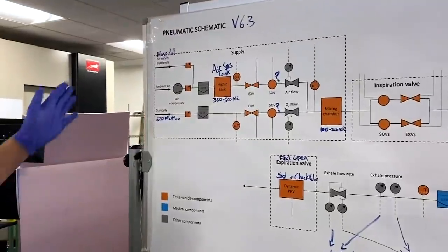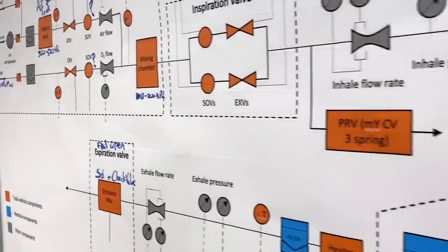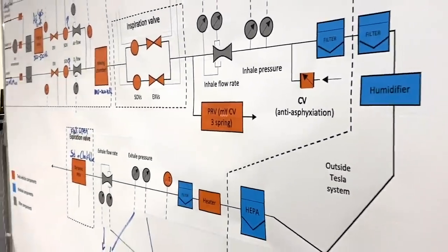So here's our kind of high-level schematic design. You can see that all the red parts here are Tesla vehicle parts. So we've used a lot of those.